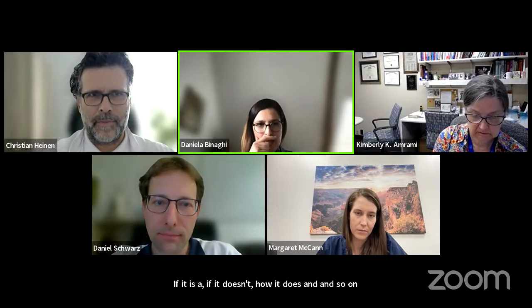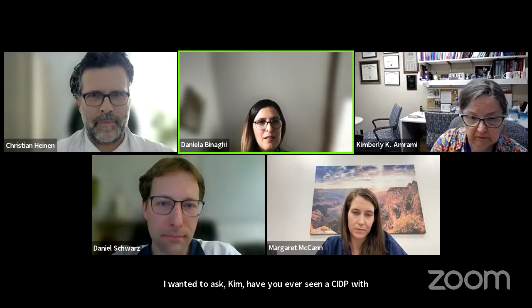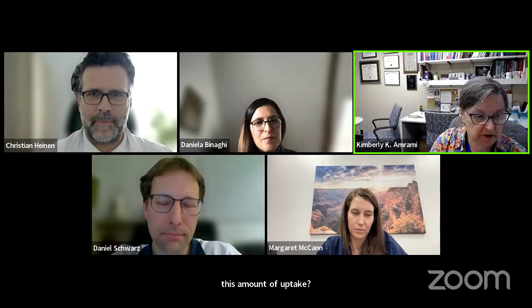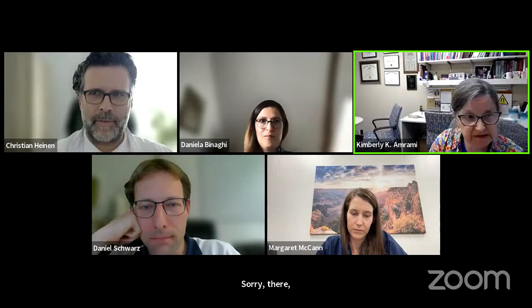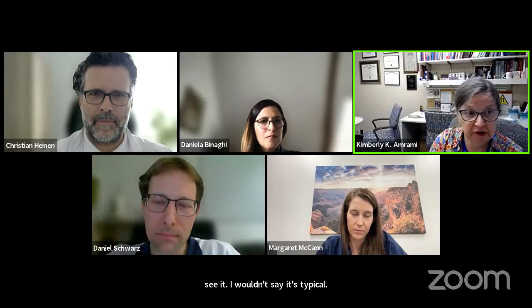I wanted to ask Kim, have you ever seen a CIDP with this amount of uptake? And we don't hear you, Kim. Sorry, hopefully you can hear me now. Yeah, we actually do sometimes see it. I wouldn't say it's typical. We looked at a series of them, and a small percentage of them do show a greater degree of enhancement.